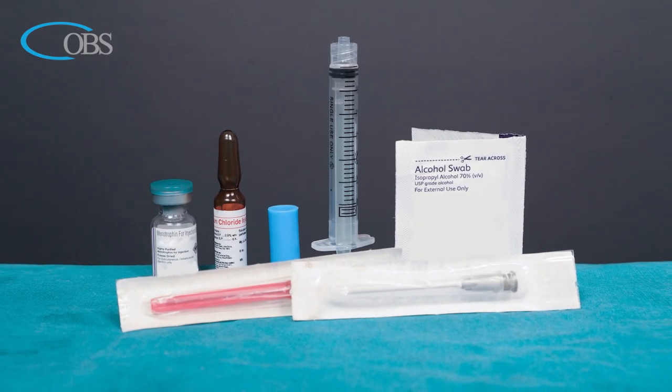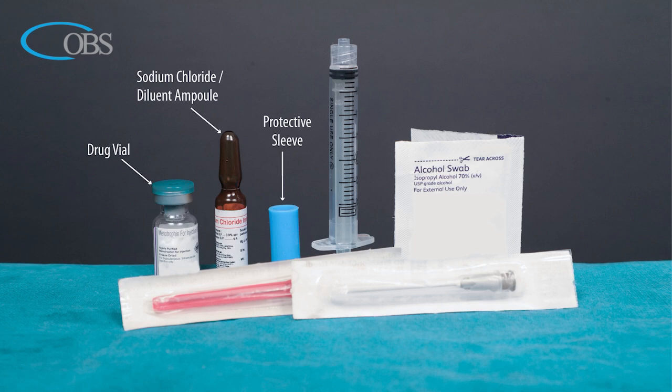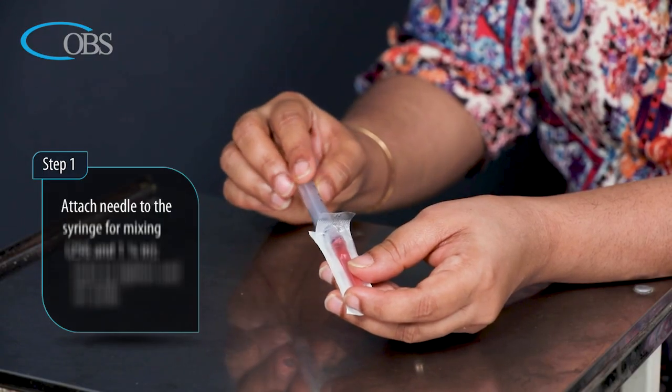Preparation first: gather all the material required for the injection. These include the drug vial, the sodium chloride diluent ampoule, a protective sleeve, a syringe, two needles (25 gauge and 27 gauge), and two alcohol swabs.